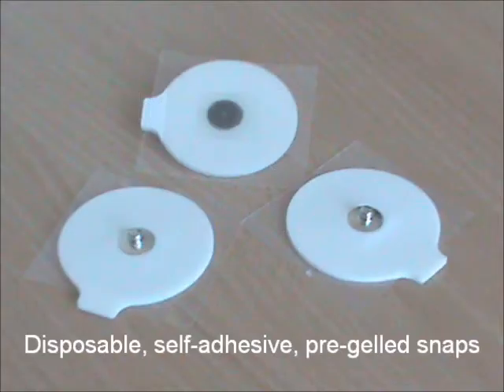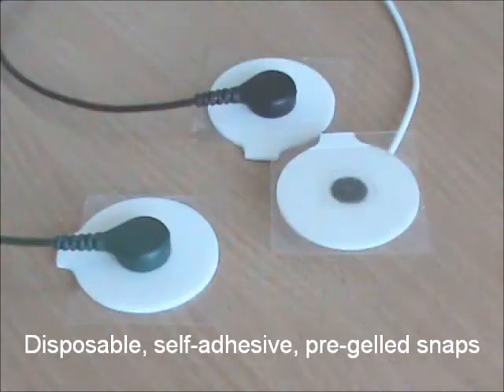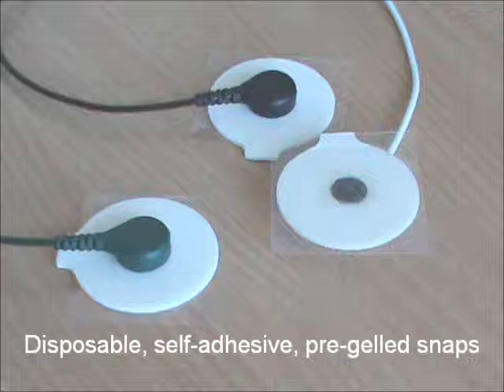These are the disposable pre-gelled snaps. The gel is a conductive medium that gives you a better electrical connection. Using this type of snap gives you a more accurate reading than the gel-free version. They simply snap onto the heads of the sensor cables. Then just peel off the plastic and stick them onto the skin.